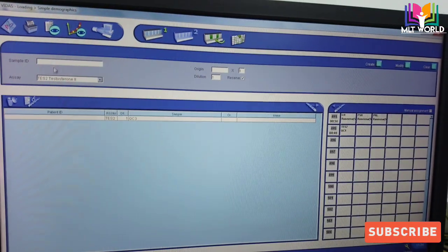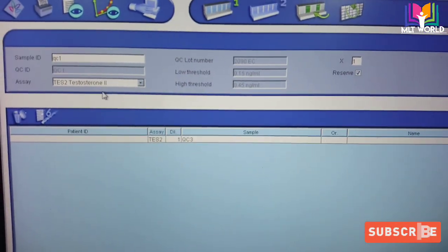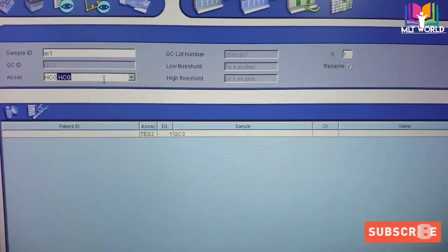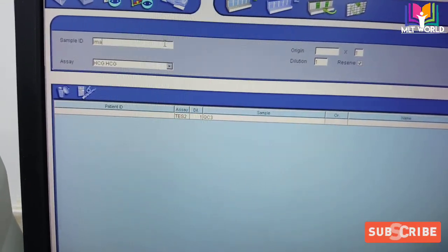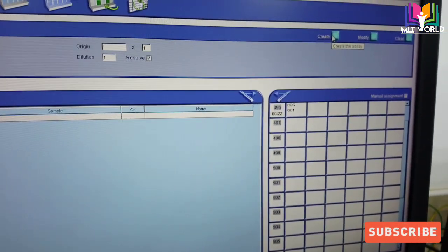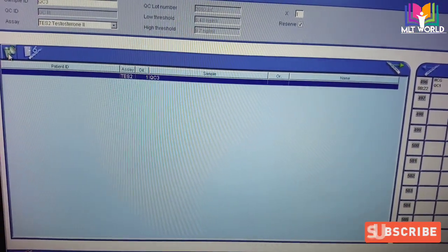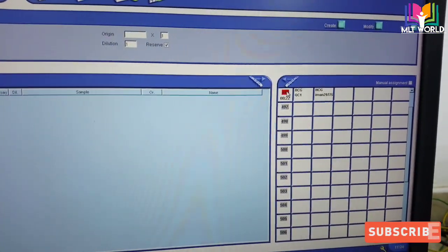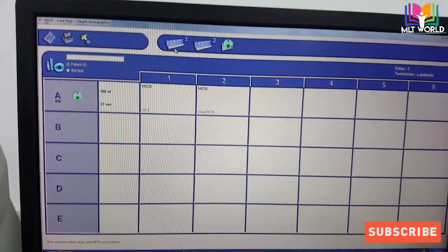There are different machines and kits available. I am showing the VIDAS machine and how to perform the HCG test on it. First we program the control, then the patient name. Every machine has a maximum readable range — in VIDAS the maximum is 1,500 mIU/mL without dilution. I recommend first doing a pregnancy rapid test: if it is a strong positive, proceed to dilution; if it is a weak positive, no dilution is needed.